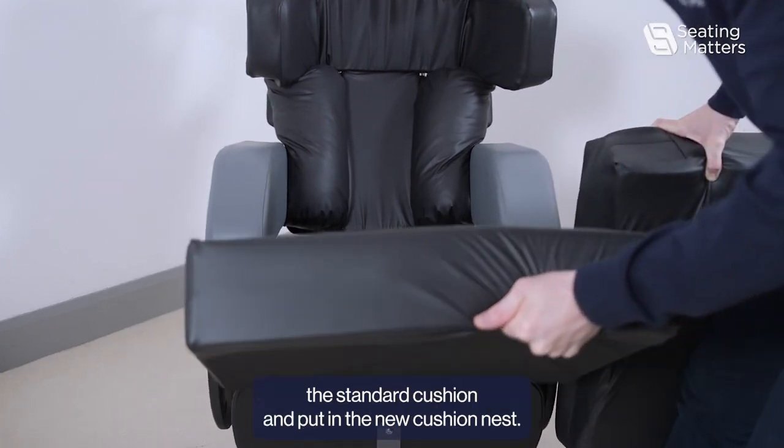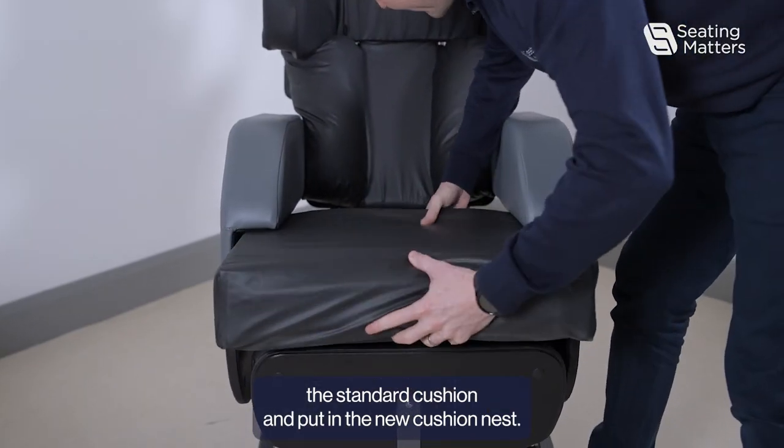Then simply remove the standard cushion and put on the new Cushion Nest.